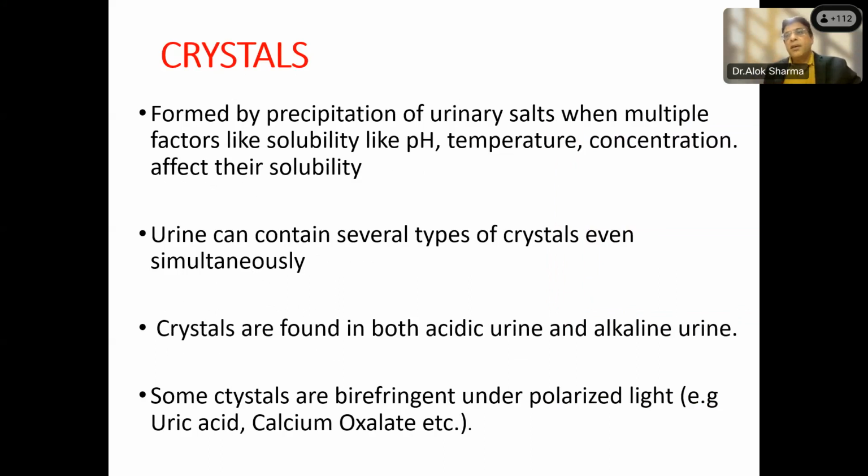Now the last part. We've covered the basic pathology, right? We've talked about the cellular elements, we've talked about the casts, the various kinds of casts which you can see, and then we come to the crystals. Looking at crystals and identifying them in the correct clinical context is also a very important part of urine sediment examination. It is useful to remember that these crystals are from a precipitation of urinary salts, and there are numerous factors which affect this: pH, temperature, and the urinary concentration. These things affect the solubility and cause their precipitation.